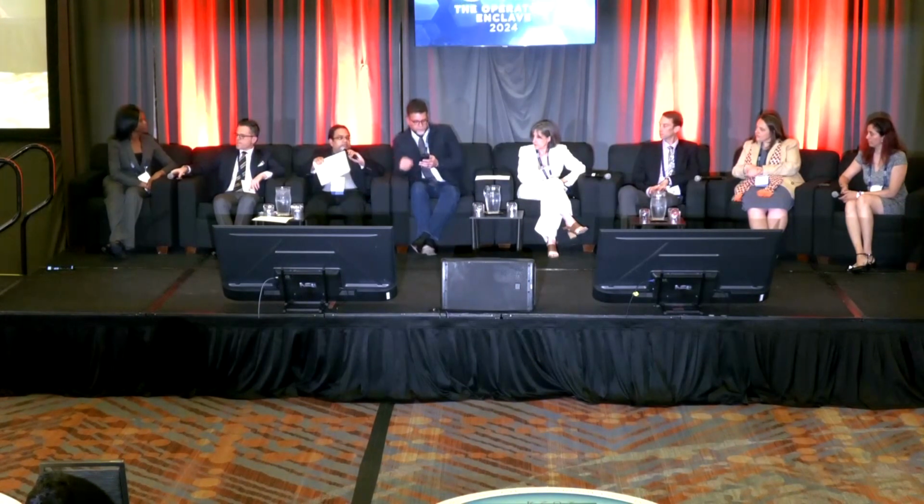Yeah, I totally agree, and I would like to add good preparation of the lesion. Sometimes lesions heavily calcified, we tend not to treat adequately, then we have trouble delivering. So I believe here was a combination of the lesion and also the tortuosity there. I think the other last point is making sure the stent, when you take it out, if you're not going to deploy it, is still on the balloon. That's an important thing to look at.